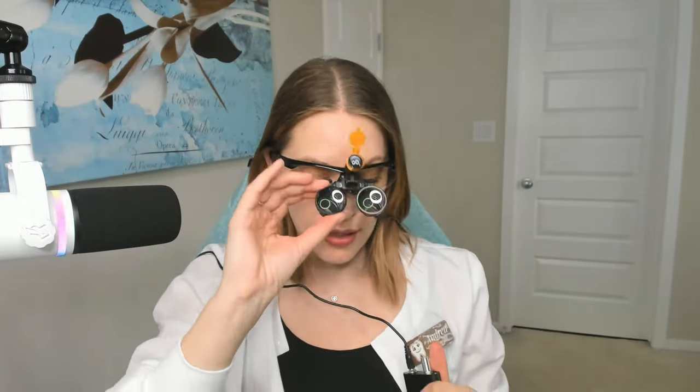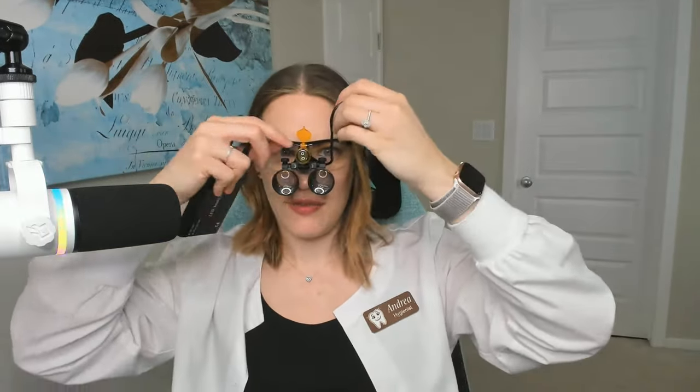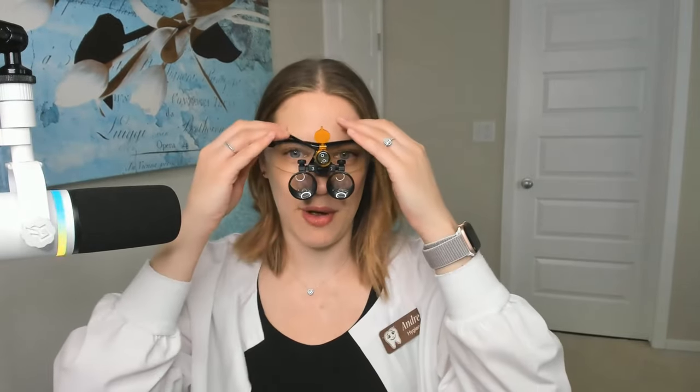So this is what it looks like with the light. What you want to do is put the cord above you. I did already attach this, but anyways, you want to put the cord above you. It's actually hard to see with those magnifiers. It comes with this handy little doohickey thing. I bet that's to keep the cord in place. But just for the sake of this video, I'm going to show you what I normally do. I put it behind me and I usually attach the cord part off to the side here. So don't mind this weird cord, but I put it behind me. I put my light in the pocket of my lab coat because I do like to wear a lab coat when I'm seeing clients.